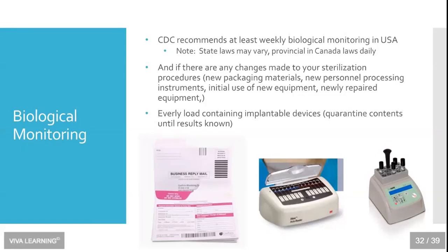In the United States, most facilities use a mail-in service, and you can see the envelope for that on the left-hand side. You are welcome to use a tabletop device, as you can see in the middle and the right-hand side of the slide as well, but keep in mind there are requirements for logging, maintaining a sterilization log, and I'll go over that in just a moment.